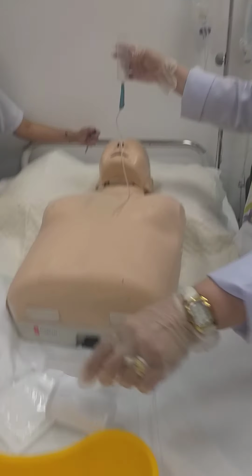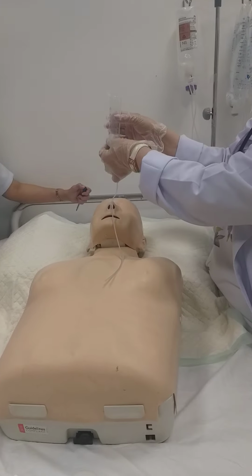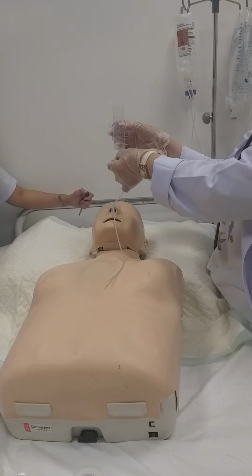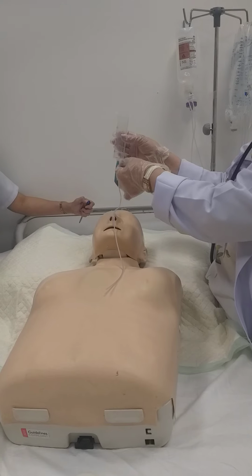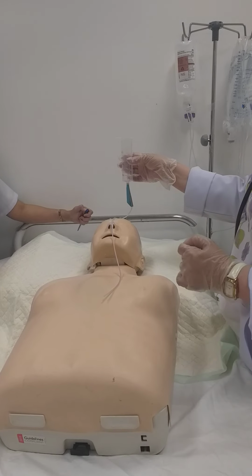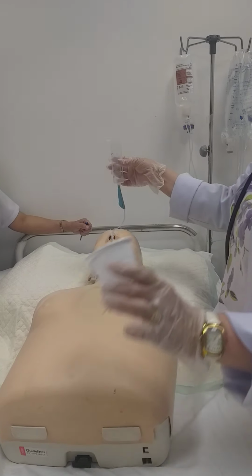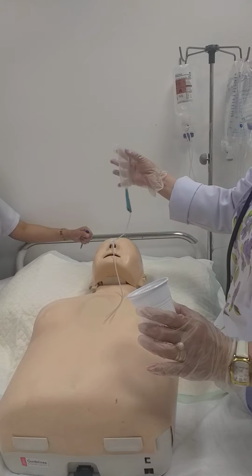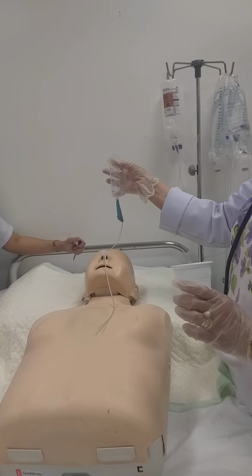Okay? So now 30 ml is running. Check not to empty this. So keep it so at least there is something here. So once you see this, the doctor now orders at least 300 ml of feeding. So we have only 50 ml here. So if it is 300, what should we do?